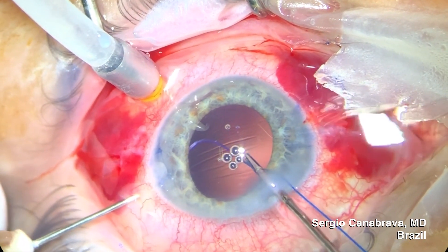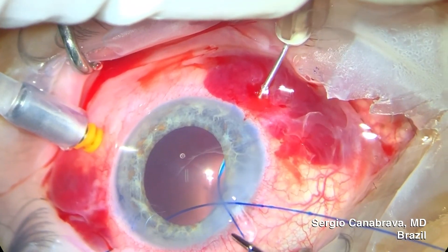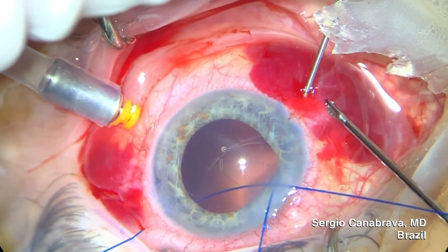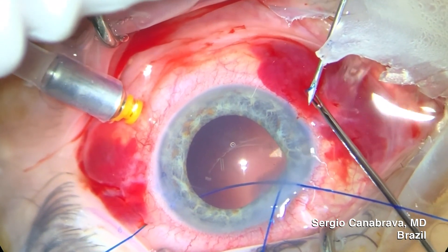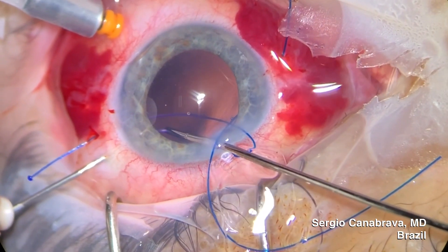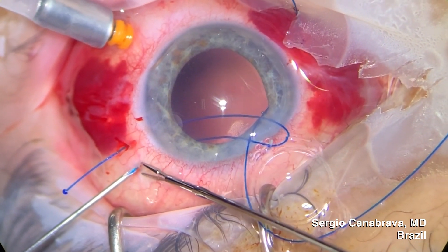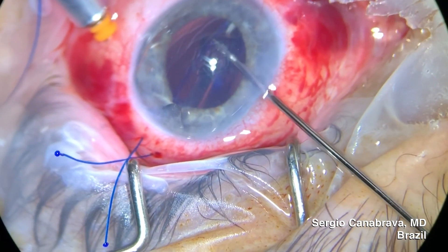In the surgery, to use the four-flange technique with the Acreos IOL, we used the same principle as we've been using. We passed through the sclera two 5.0 prolines, and each wire will be coming through the other end with the help of an insulin needle. The proline will go through the haptics of the IOL and will be pulled out parallel to where we went in. After that, we repeat the maneuver on the other side. With the Acreos IOL, we have the proline coming out in four ends, two on each side.